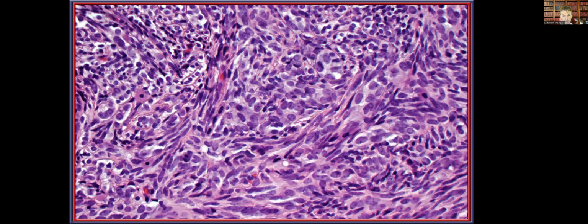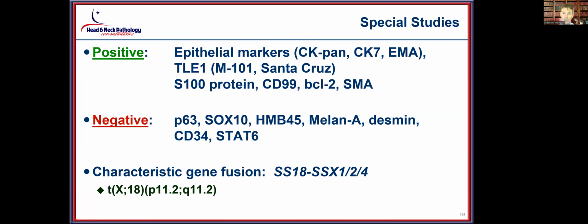Here you will notice epithelioid type cells. I think you can all see that these are quite epithelioid in their appearance, almost giving you a glandular type feel, while the rest of them are spindled in these fascicles. So this would be an example of a biphasic synovial sarcoma as an uncommon entity within the sinonasal tract area. Be aware that they will be reactive with epithelial markers.